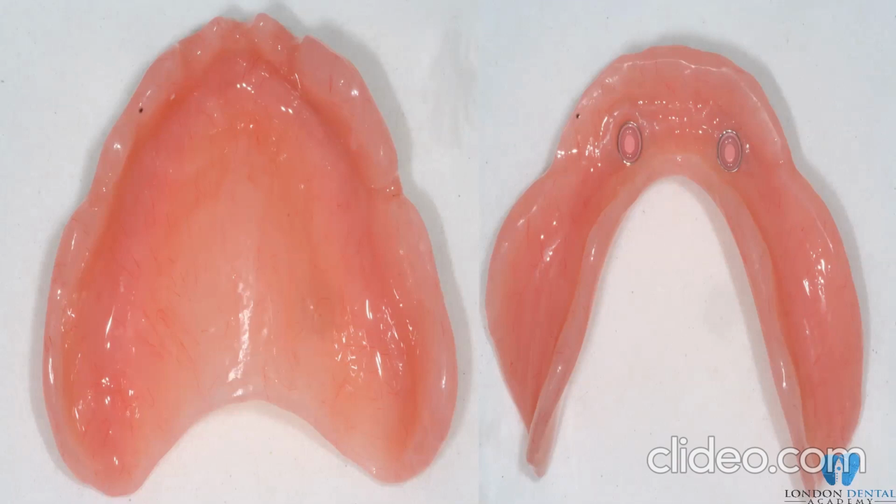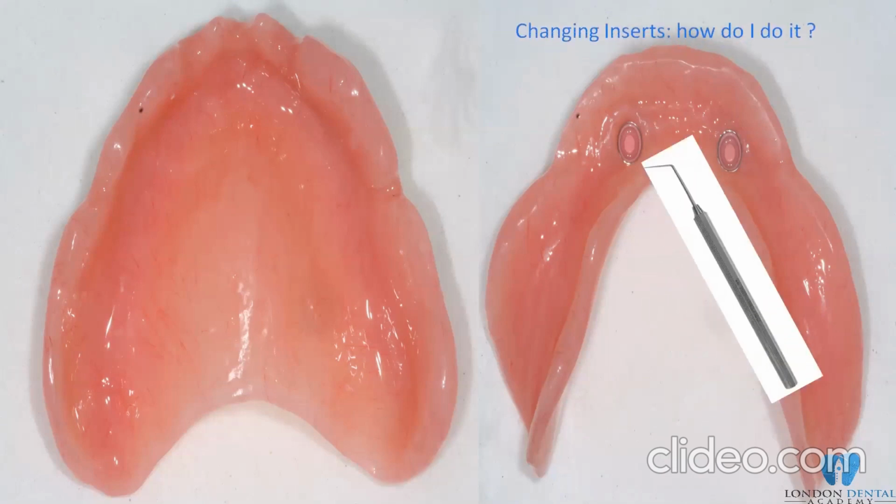If I ask you what the tools are, you tell me the locator removal kit, and there are two or three, costing me a few hundred pounds. I see one or two patients a year. I don't think it's worth the investment. So I want to show you something I use on a regular basis. Probably all of you know this magic instrument in any dental practice, the dental probe. As you can see, that's all I use for changing the inserts.